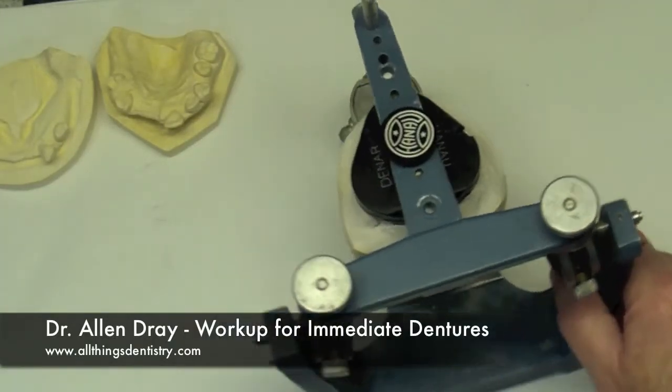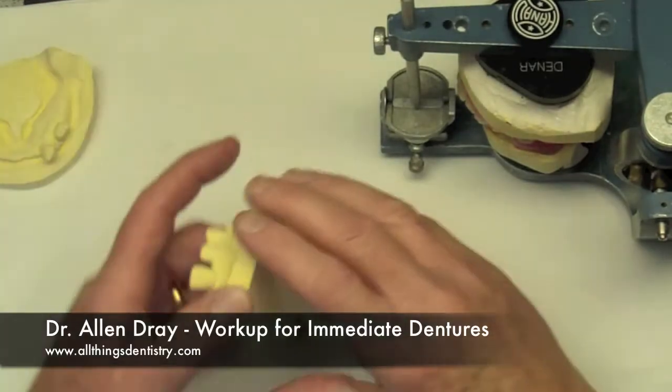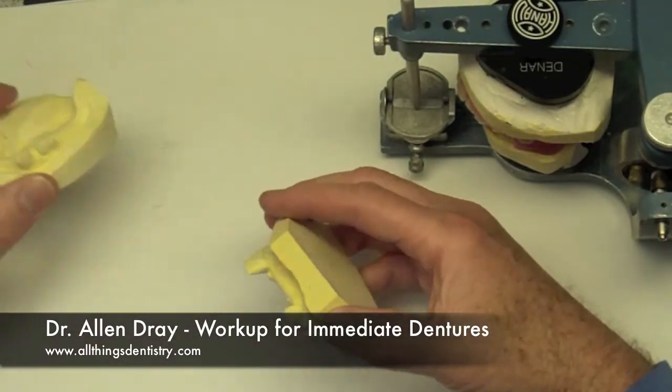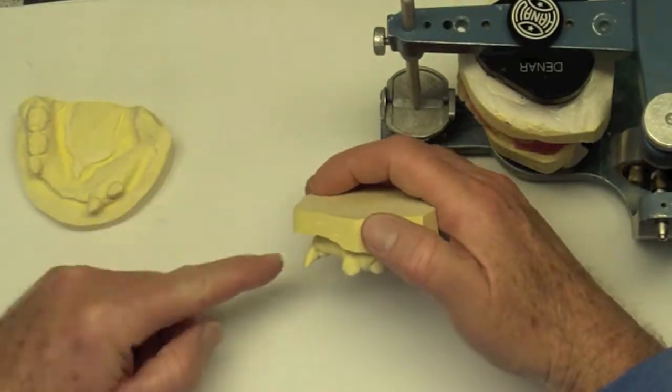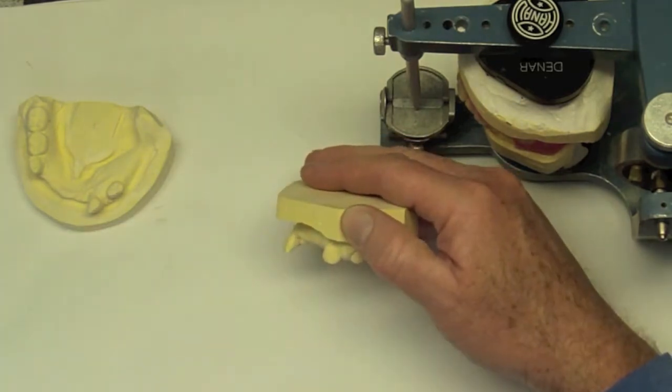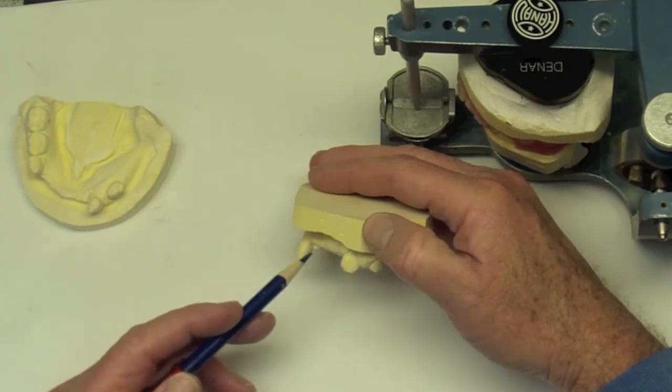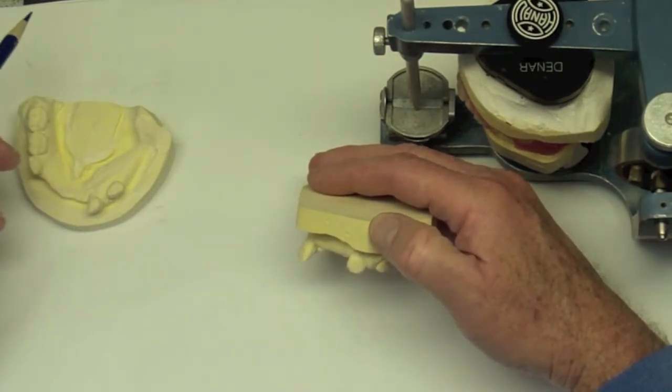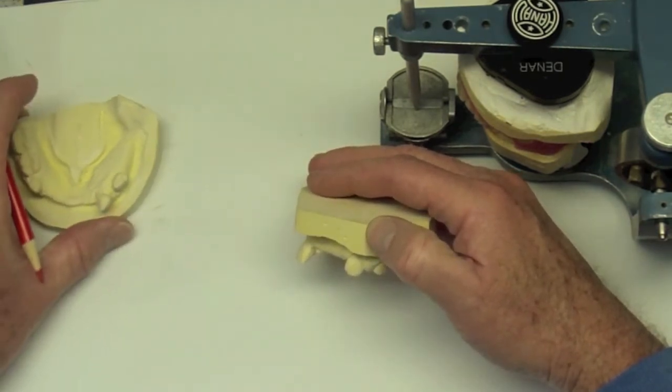For this patient, this is the individual and we have clinical photos who has extremely proclined central incisor and also he has an additional issue of having maxillary excess which becomes quite obvious as soon as you see the clinical photos.